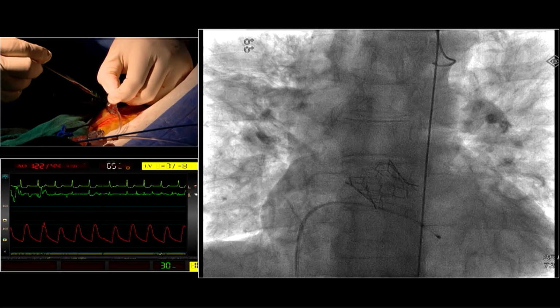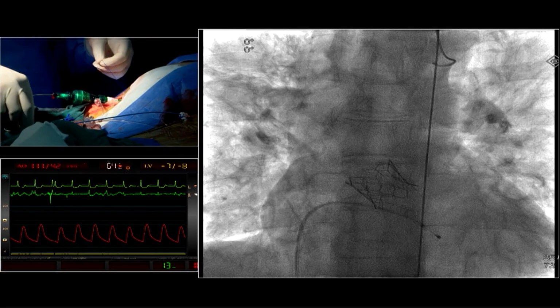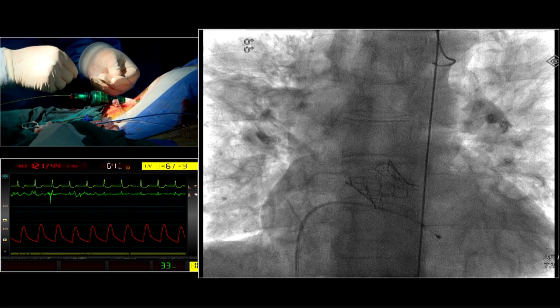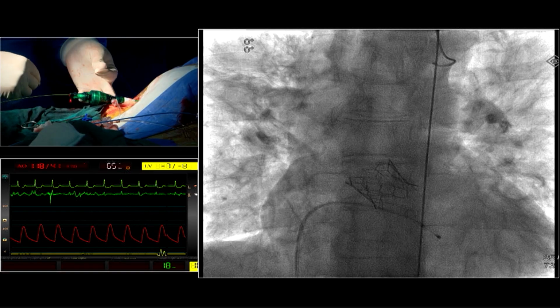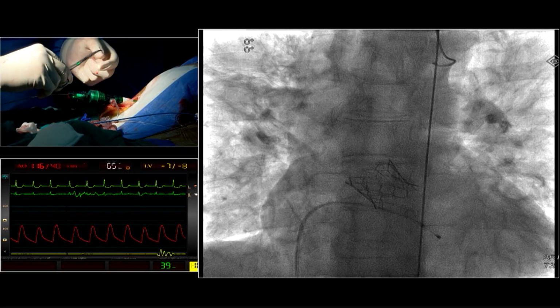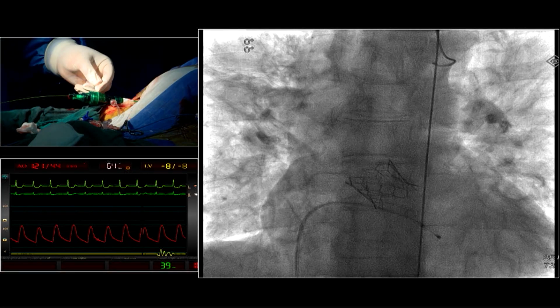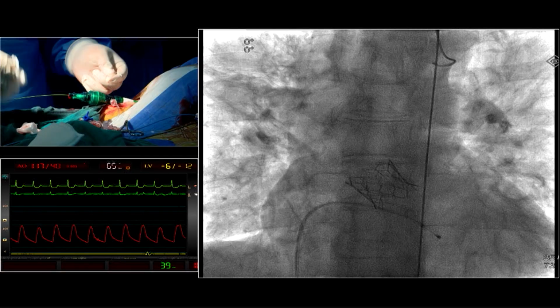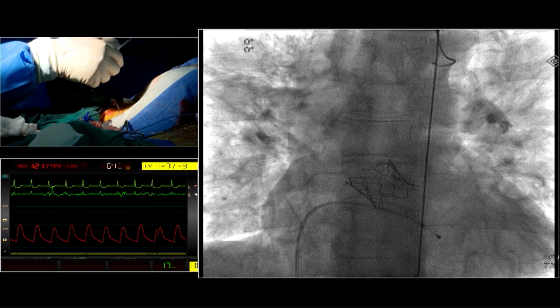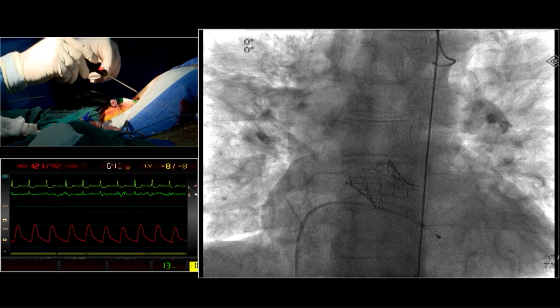Next we are going to take the suture out for the Python sheath. We will release these threads and we are going to wet these threads so that they act nicely. And we'll again separate them, make sure that there is no entanglement in between these two threads. And I'll attach the artery forceps again to the white one. Again, I'm going to wet this thread and put a knot pusher over it. So typically you roll this like this and then catch this thread and let it slide down.